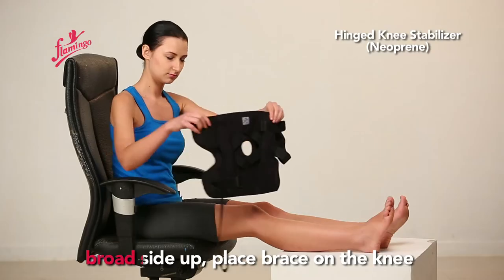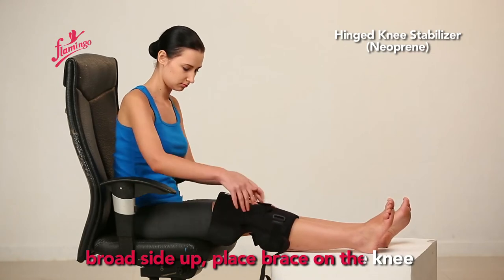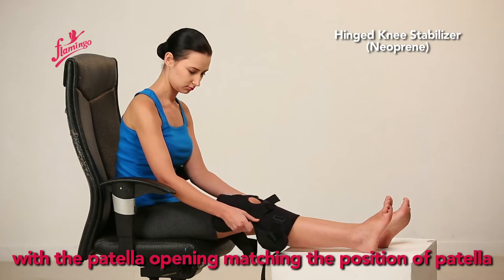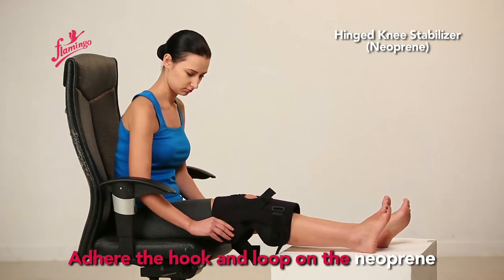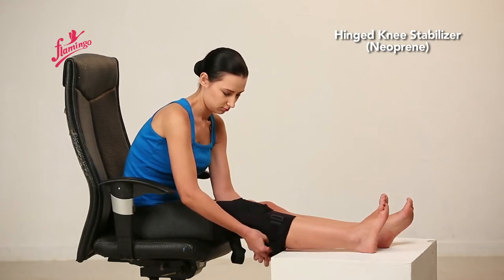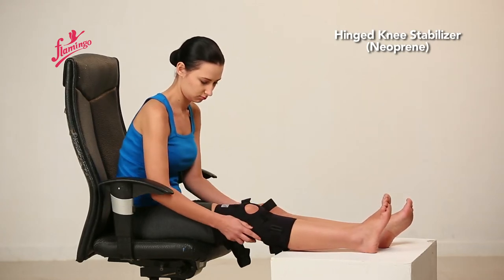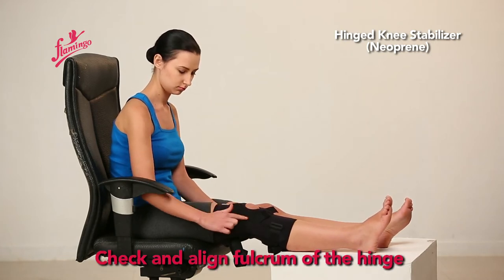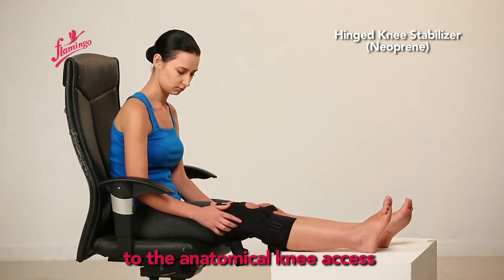Broad side up, place the brace on the knee with the patella opening matching the position of the patella. Adhere the hook and loop on the neoprene. Check and align the fulcrum of the hinge to the anatomical knee axis.